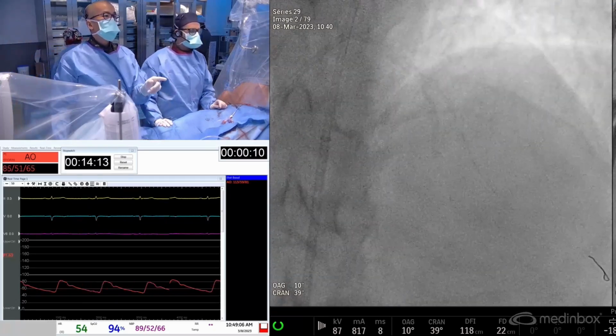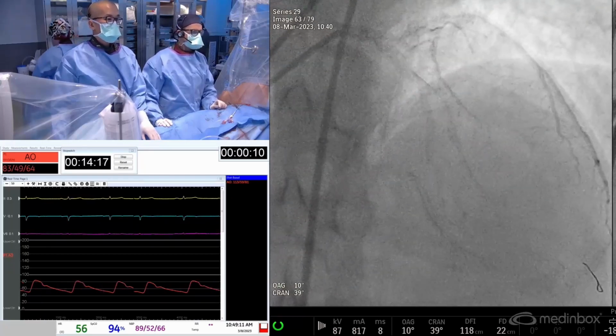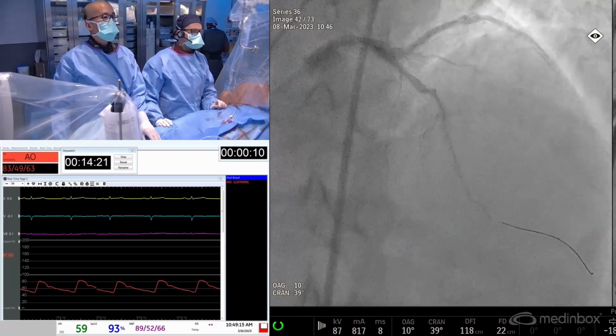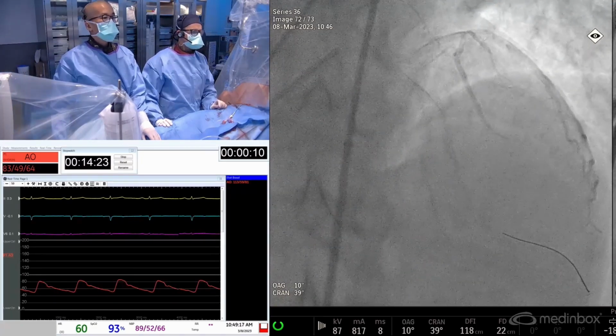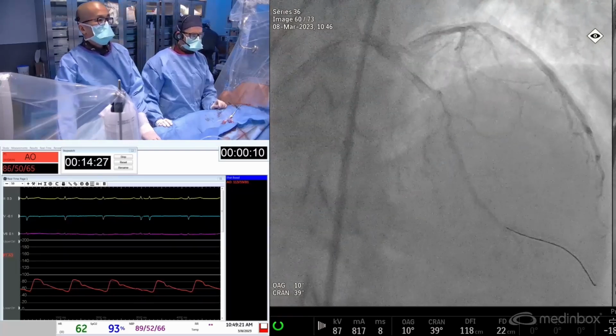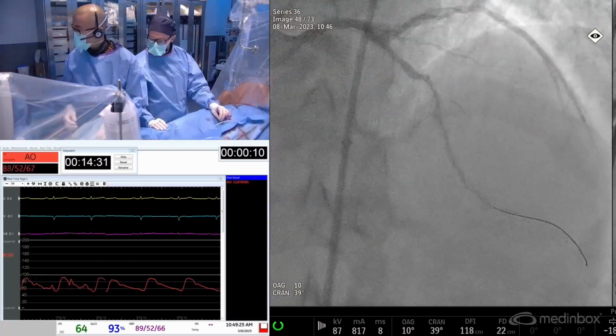We didn't save it. No. There you go. So this is what you're seeing post initial 1.5 burr. Now I'm going to show you the post with a lot more nitro. You can see the distal bed is lightened up. So that's actually very good.